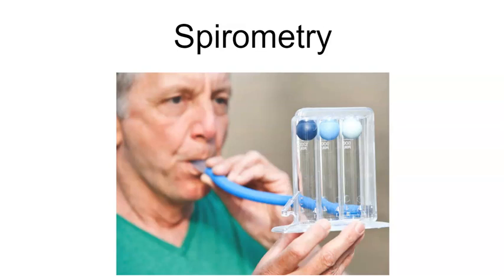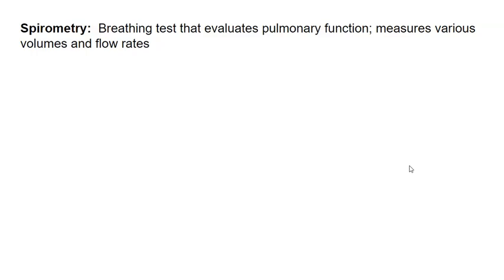Spirometry is a way to test lung function. So this man is breathing into and out of what's called a spirometer. Spirometry is a breathing test that evaluates lung or pulmonary function, and it measures various volumes and flow rates of air.